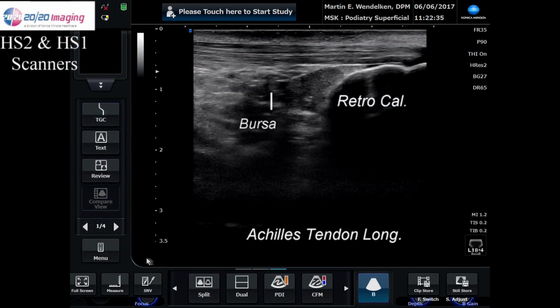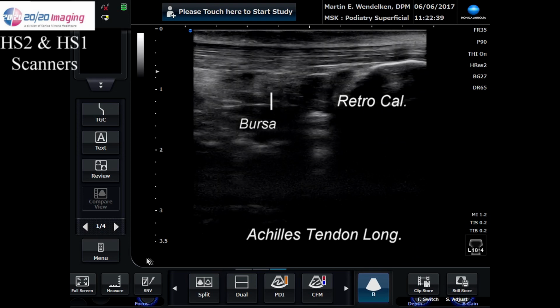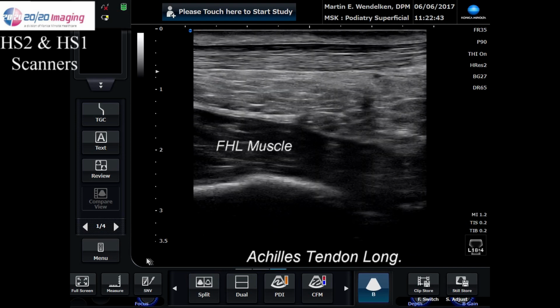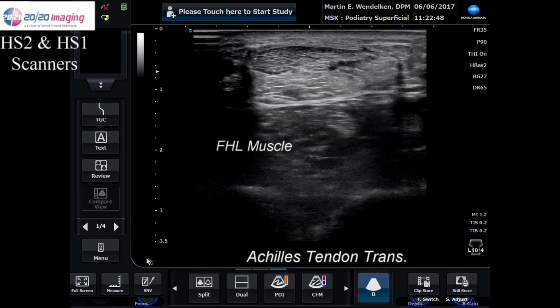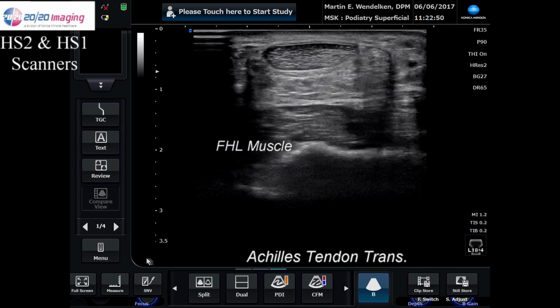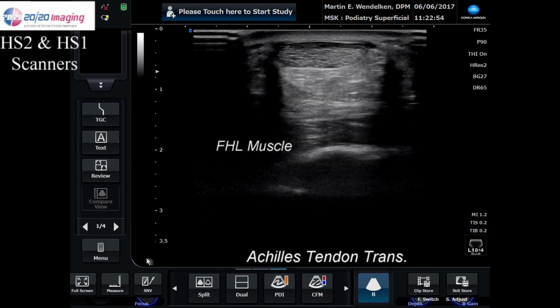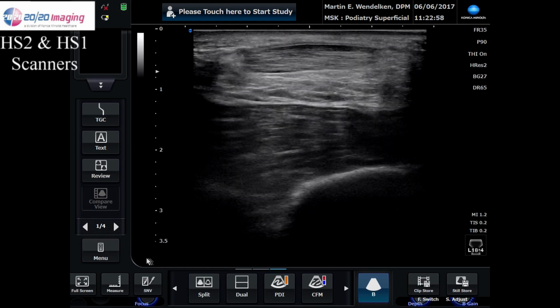Now, directing the attention to the retrocalcaneal surface and the Achilles tendon. If you look at the screen, to your right is going distal, to the left is going proximal. Here I'm going proximal. I'm looking all the way deep, all the way down to the surface of the tibia. I've now switched to transverse, and you can see the beautiful image of the tendon. You can see the edge shadowing.